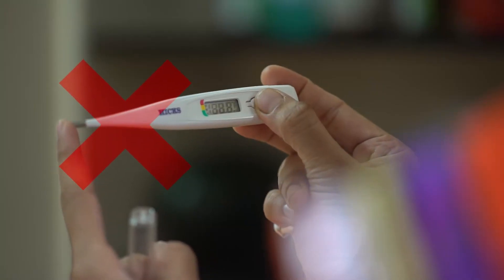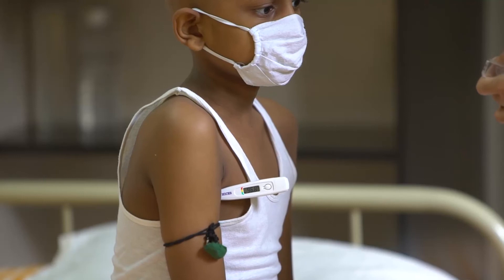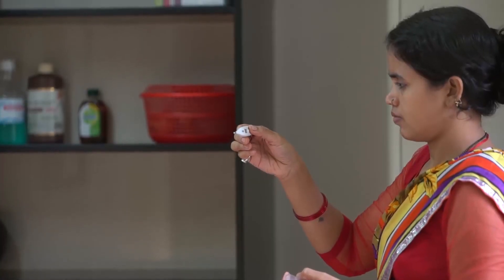Avoid touching the bulb or the tip of the thermometer as this may result in an inaccurate reading. The thermometer will make a beeping noise once the final reading is done. Remove the thermometer and check the temperature reading.